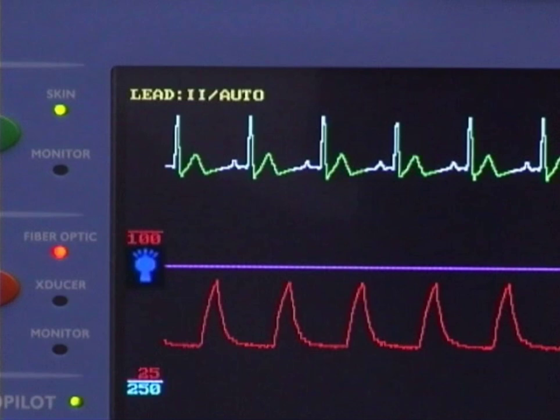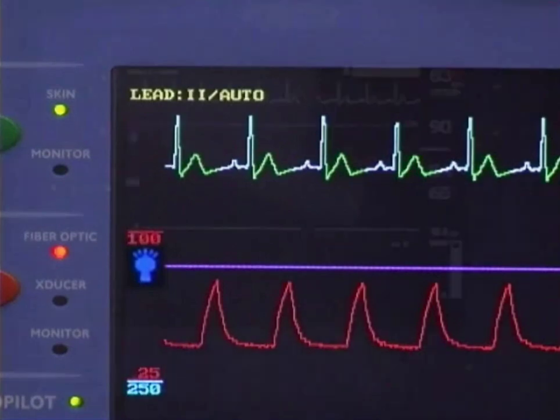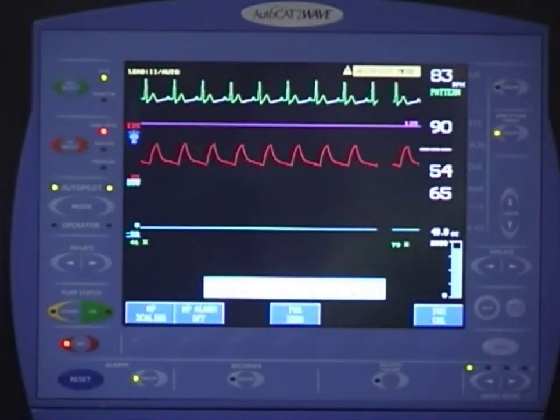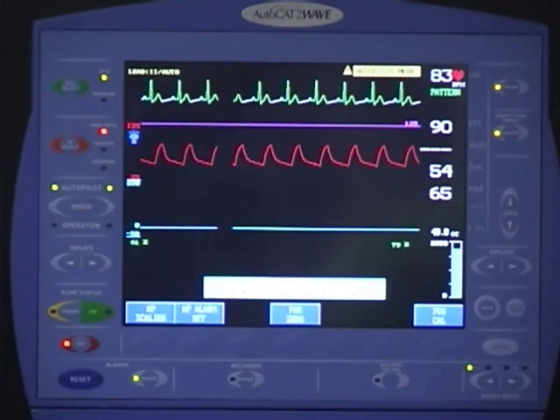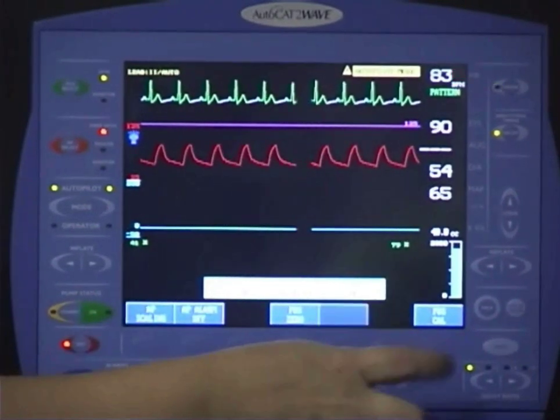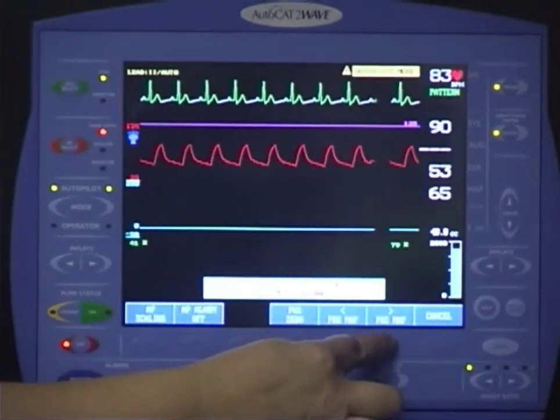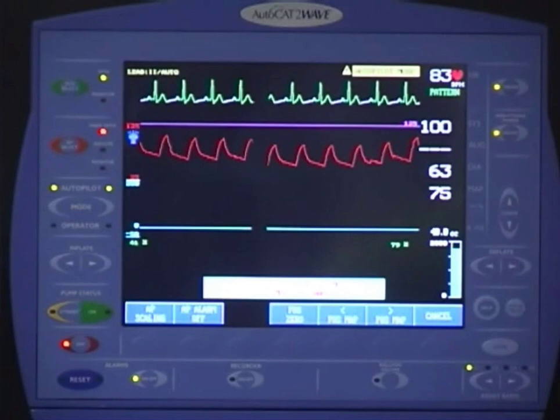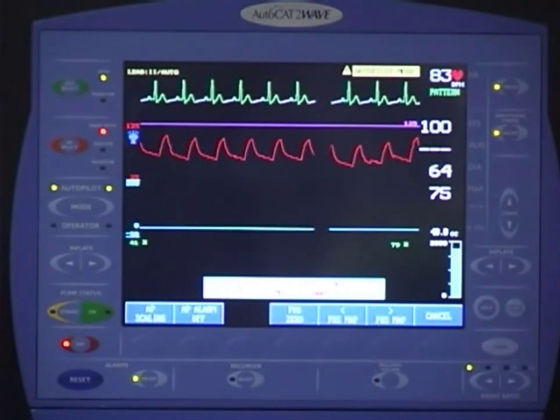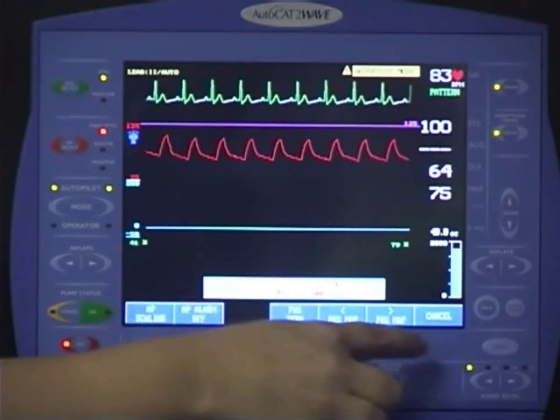Use the MAP pressure from a known accurate arterial pressure line in the patient as the guide. Press the AP select key once to bring up the function keys at the bottom of the screen. Press the FOS Cal key, then press the increase or decrease key until you reach the desired value. If you entered a value that is not correct or if you change your mind, press the cancel key.